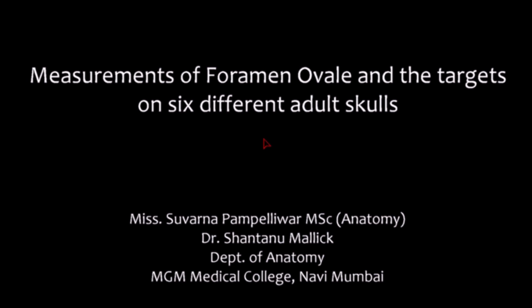Now I will show you some measurements related to the foramen ovale when you are coming inside to reach your target. The measurements were taken by our MSc student, Ms. Suvarna. I am highly thankful to her. Let's see the measurements.